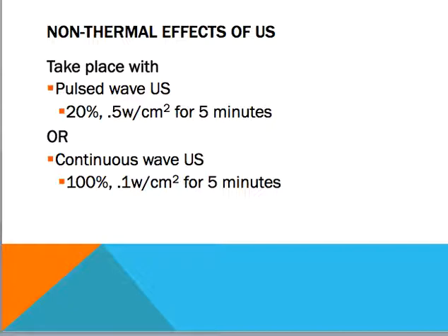When we talk about non-thermal effects of ultrasound, I want to clarify that anytime you turn the machine on, you're going to get non-thermal effects of ultrasound. So changing the cell membrane, the acoustical streaming, and the stable cavitation. So whether you add heat or not. We can get non-thermal effects or non-thermal ultrasound with these settings. One is pulsed wave ultrasound at 20% pulse, 0.5 watts per centimeter squared for 5 minutes.